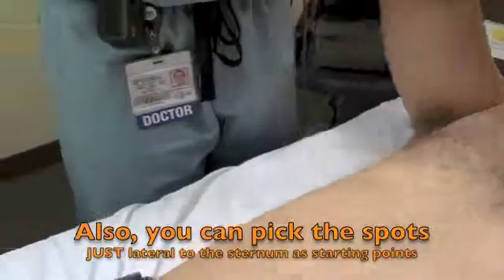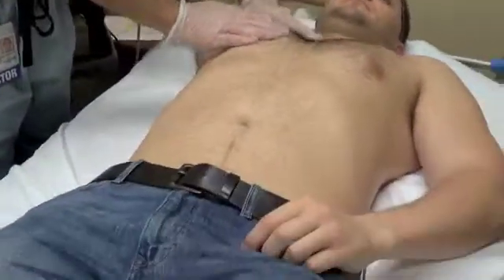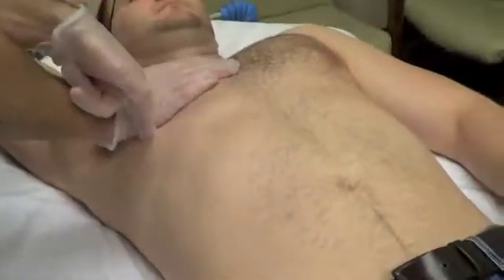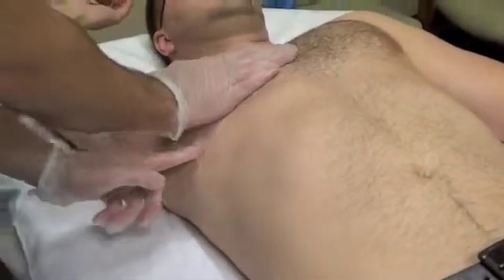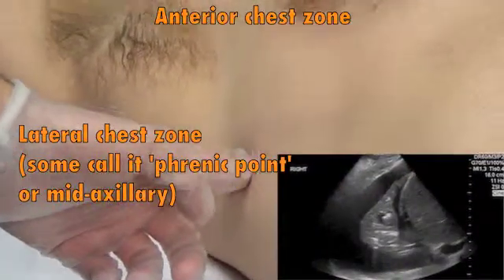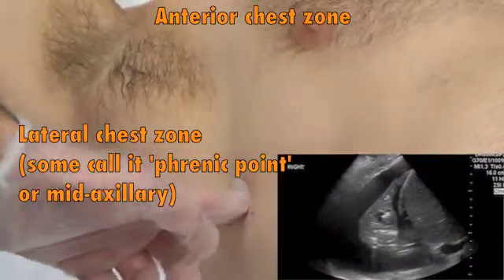On the lateral side, we follow from the same points — our right palm — and you can see that our right pinky makes a line, which we call the phrenic line. We follow it to the mid-axillary line. This would be where we use the ultrasound probe on the lateral lung zones.